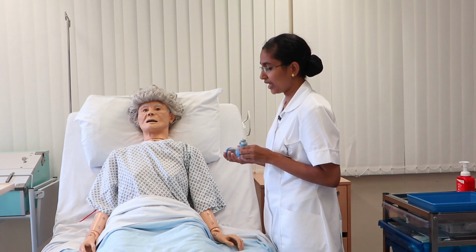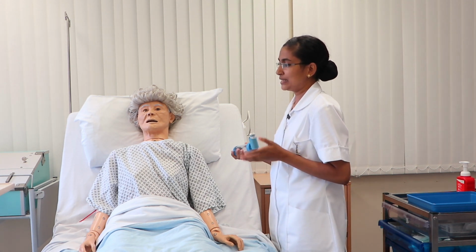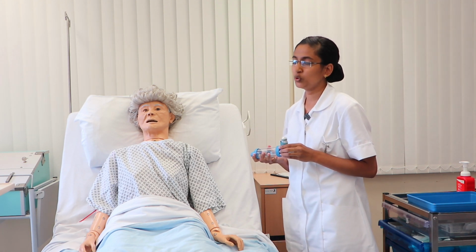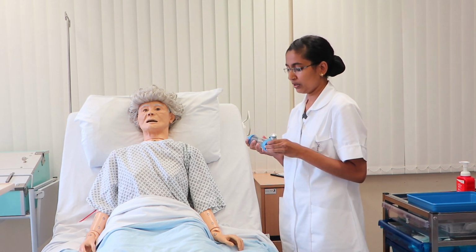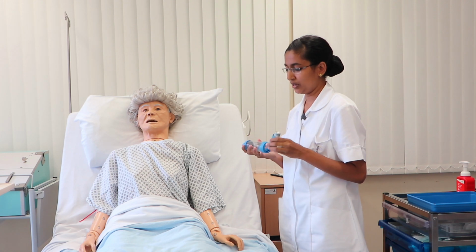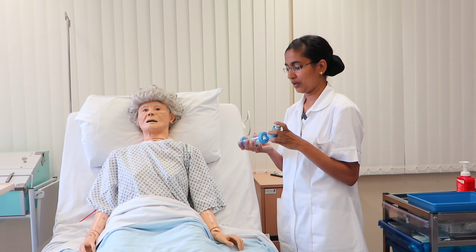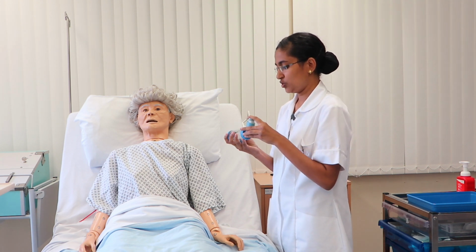Okay, so I have to wait for 30 to 60 seconds if this is the same medication. If it is a different medication, I have to wait for 2 to 3 minutes, and before the second puff I have to remove the canister and shake it for 2 to 5 seconds. 1, 2. Now I will connect it again with the chamber.